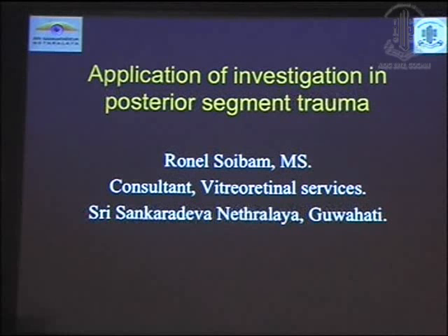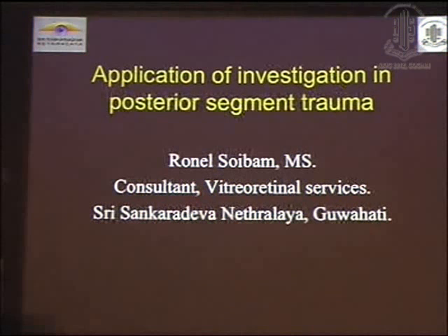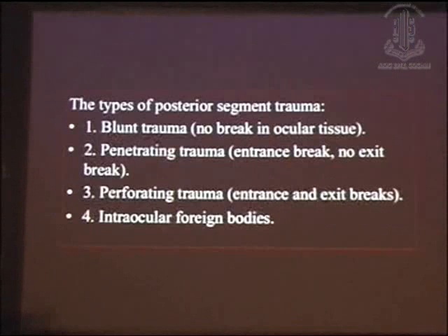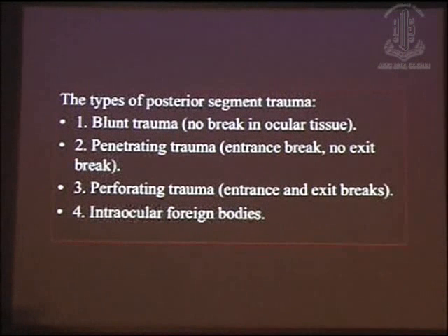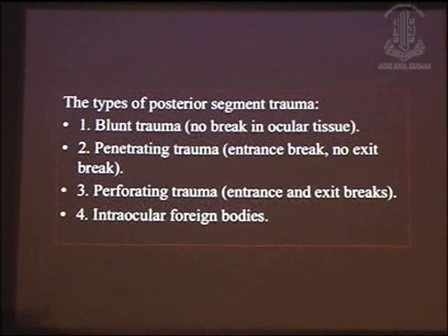Today I am going to present applications of investigations in posterior segment trauma. I have no financial disclosure in this presentation. The types of posterior segment trauma may be blunt trauma, penetrating trauma, perforating trauma, or intraocular foreign bodies.